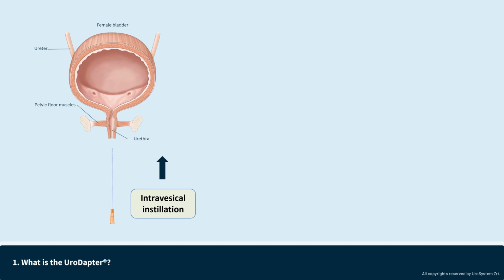The main indication of urethral catheters is to drain the urine from patients, either because they have an obstruction, like it happens sometimes in elderly men, or they are in no physical condition to spontaneously empty their bladder. And for this purpose, catheters are well designed and a necessary choice. But for intravesical instillations, in patients who are capable of spontaneous healthy voiding, there is just no need to push a catheter, basically a rigid tube, through their urethra, and the only reason we used catheters was the lack of a better alternative. So, what are the problems with catheterization?